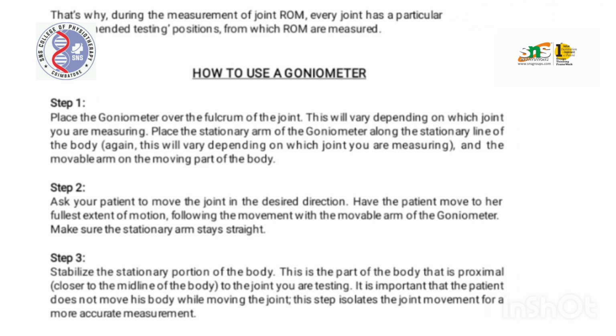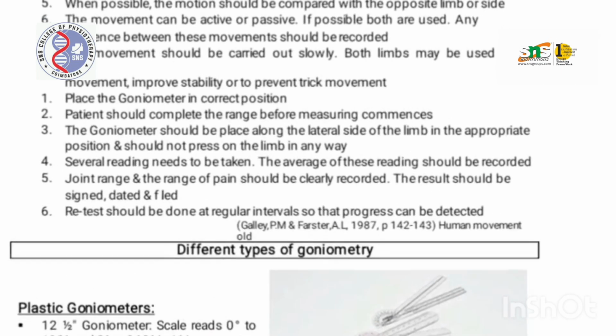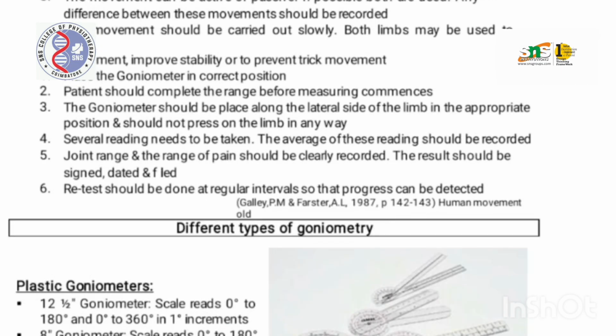Then we'll go for techniques of measurement. First, the procedure and its purpose should be clearly explained to the patient. The relevant part of the body should be undressed. At the beginning of the examination, the position of the part should be stable, in the standard position of zero.